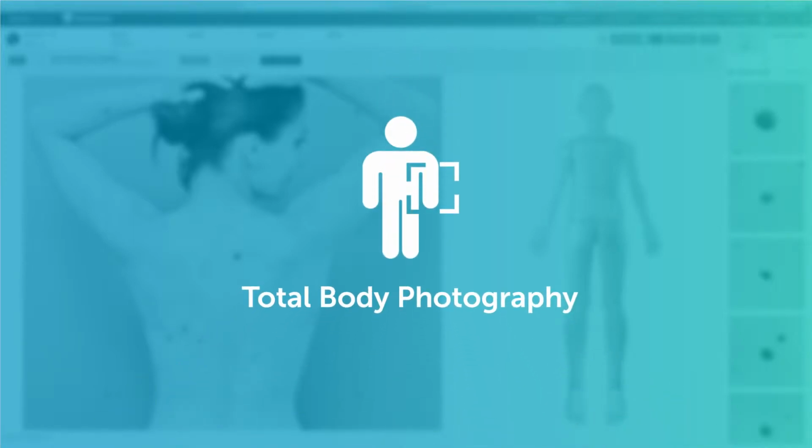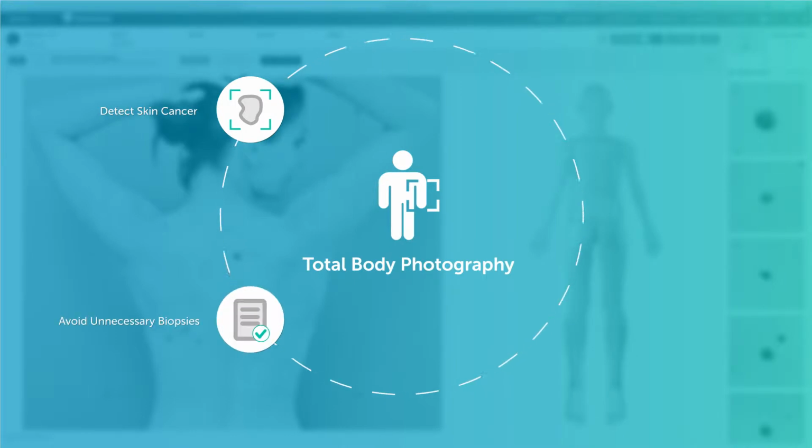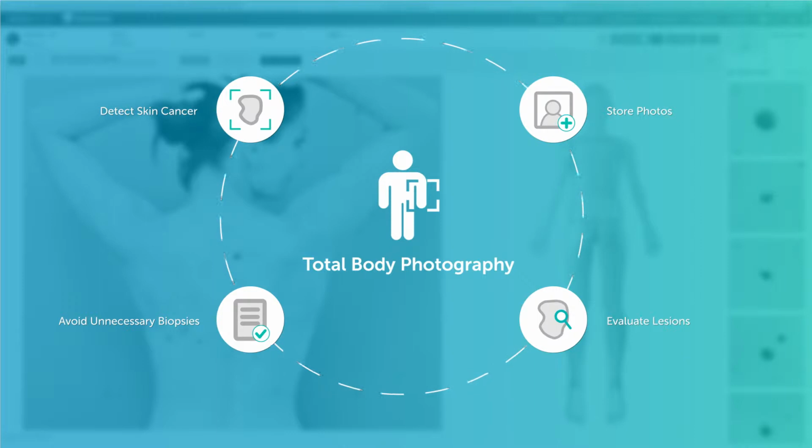Total body photography assists in the early detection of skin cancer and is valuable for avoiding unnecessary biopsies. It allows the capturing and analyzing of total body images by storing photos of different body parts and supports you in detecting new or changing lesions.